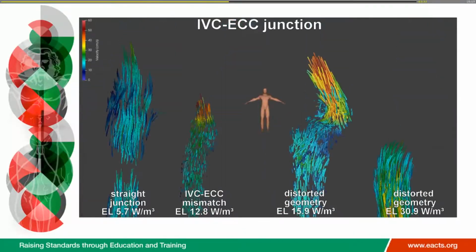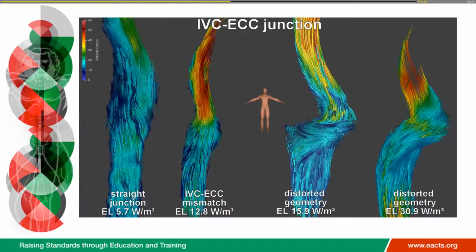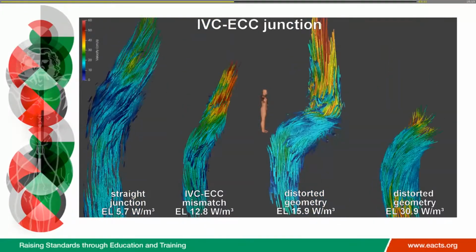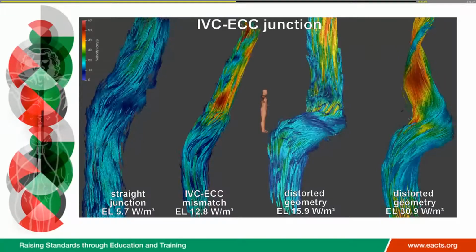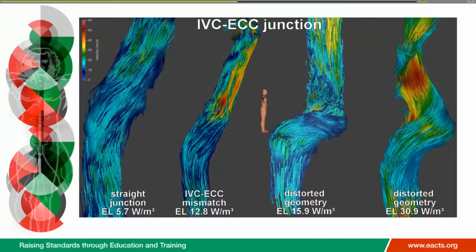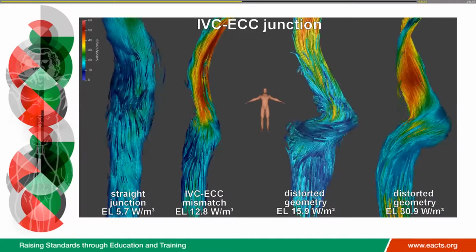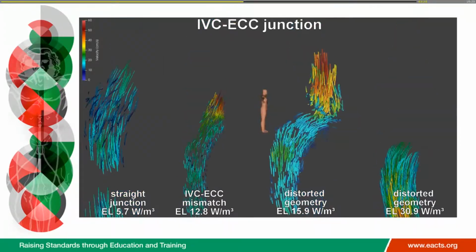So I just want to comment that we have implanted 16 millimeter over years and none of them has been removed. And as a follow-up, we have started putting bigger ones now since few years, but we all know the problems of oversizing on the potential compression of the pulmonary veins.